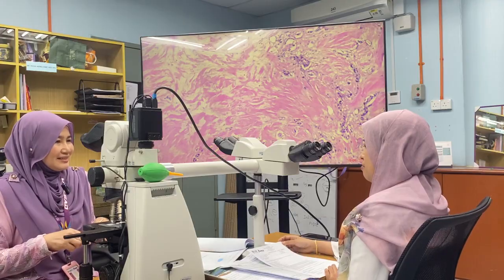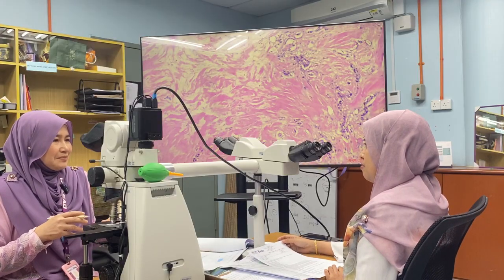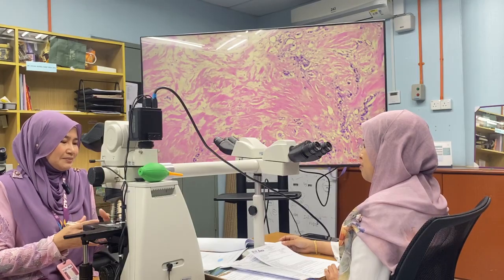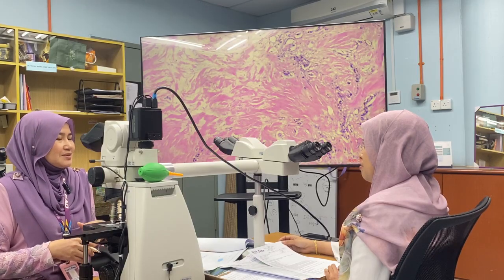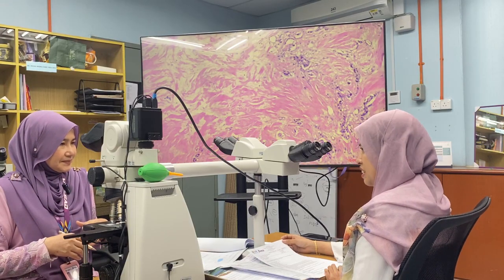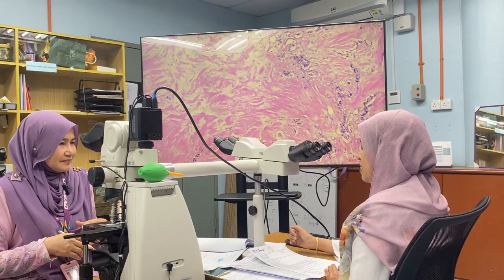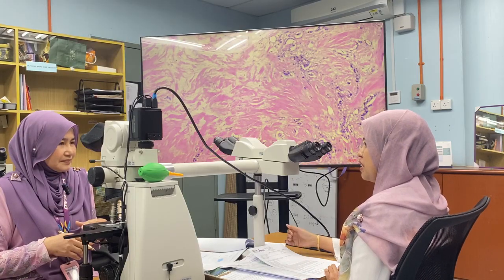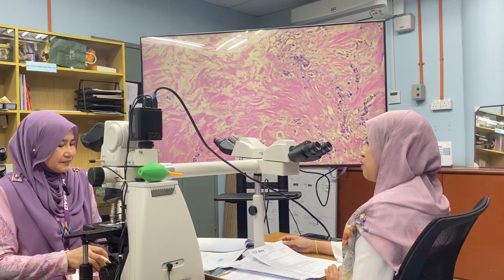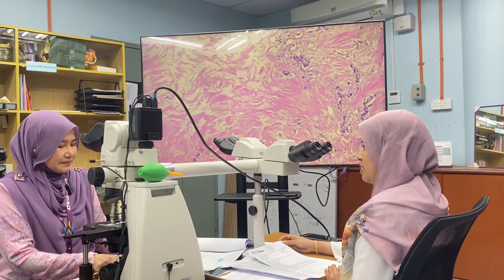Okay. What about the margins? How do we report the margin? Is it similar for the mastectomy specimen post-neoadjuvant? Principally, it's the same. We still measure the distance of the lesion to all the margins and report the closest margin and whether it is involved by the tumor.